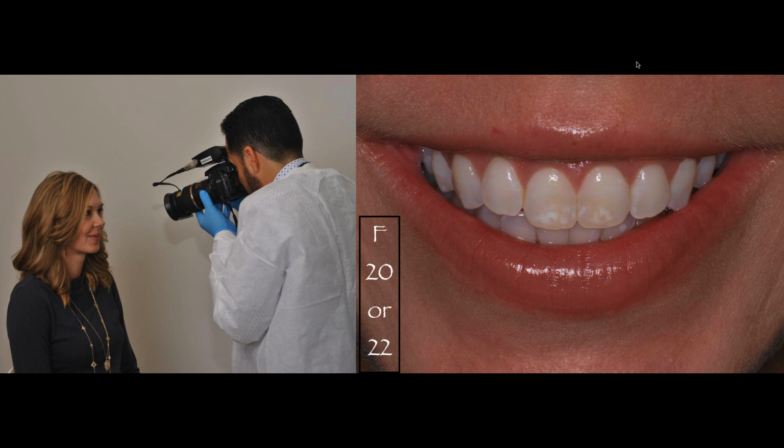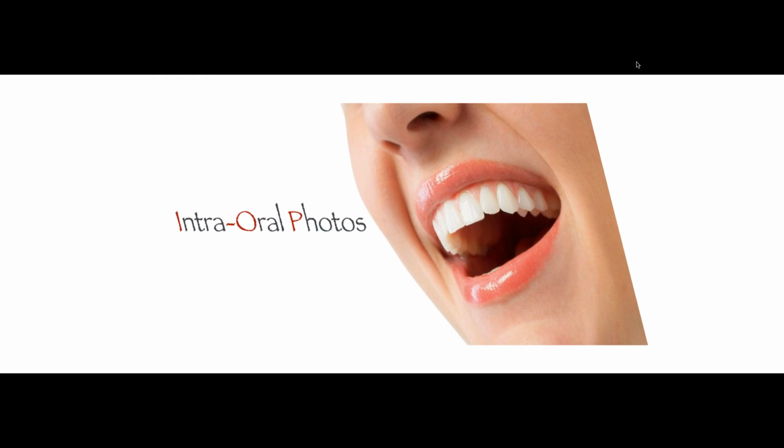Now, this is the second smile photo. What you see different between this photo and the previous one is that this photo is more straightforward. So I take one that's slightly inclined, and then I take one that is less inclined, more straightforward. So I have those 2 views of the patient's smile. And as you can see here, I'm using exactly the same f-stop, and I'm exactly at the same distance from the subject, approximately 50 centimeters away.